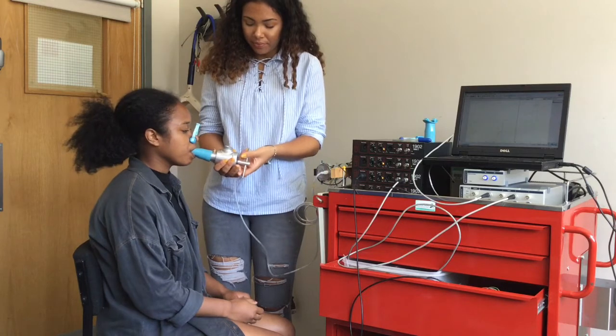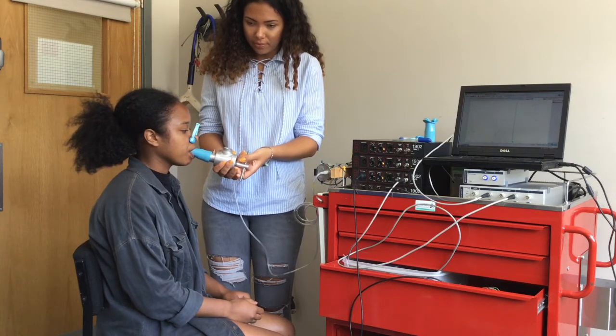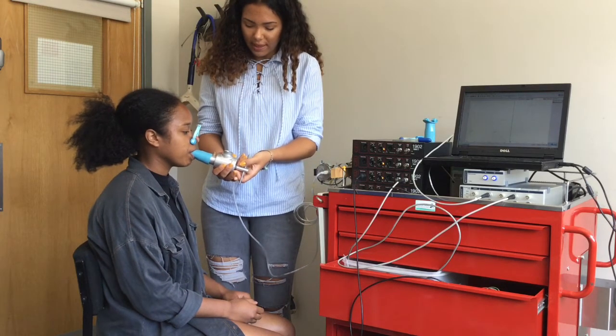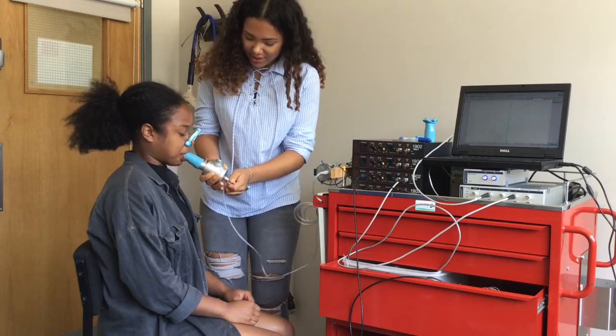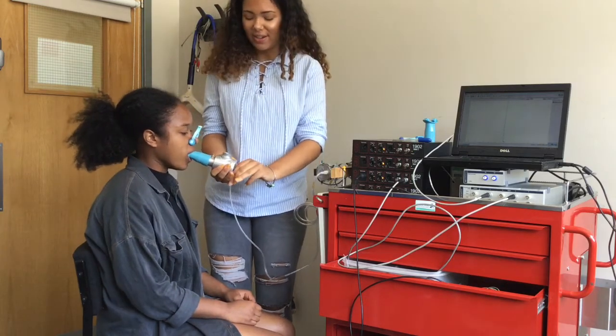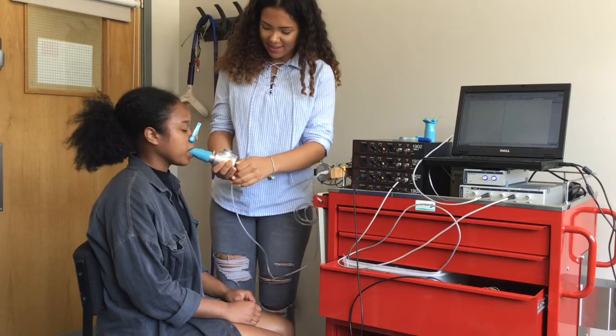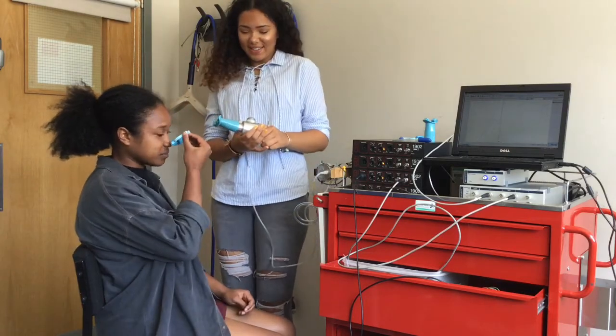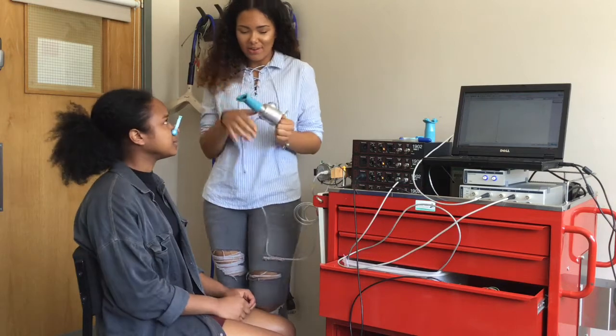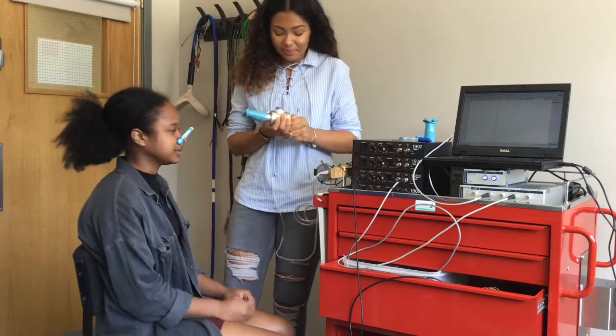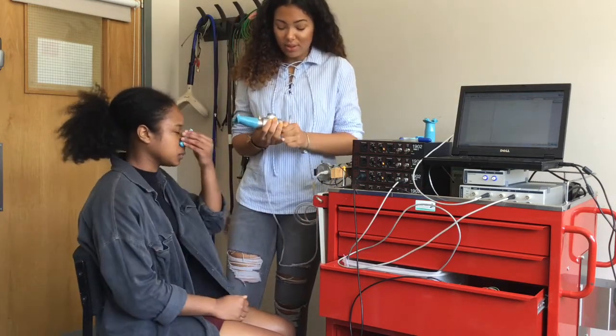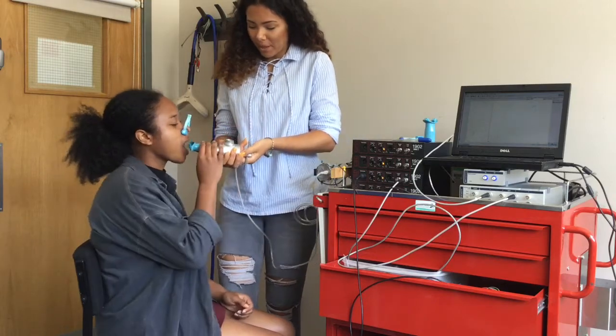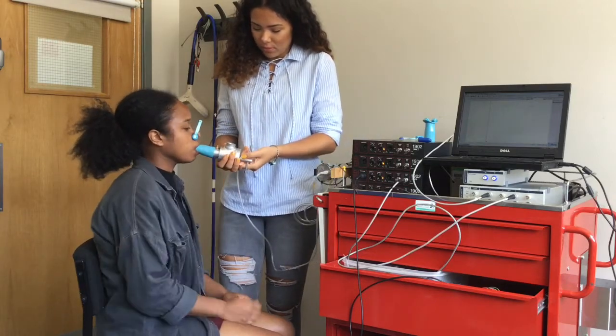For PI max measurement, the patient performs a maximum inspiratory effort from a relaxed lung volume. For PE max, the patient exhales maximally after a full inspiration. Pressure should be maintained for at least 1.5 seconds in order that the average pressure over one second can be taken. Verbal encouragement is given during the maneuver to ensure a maximal effort.